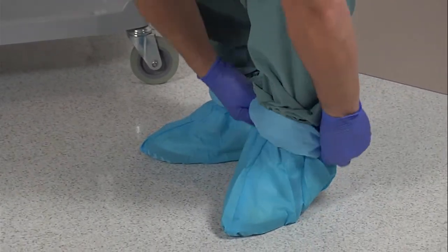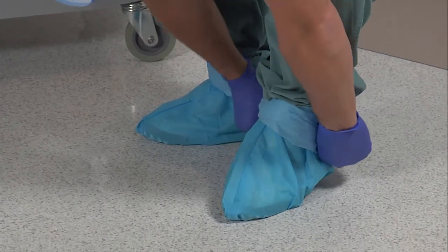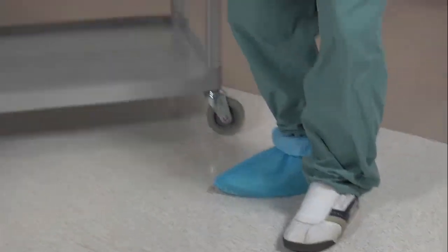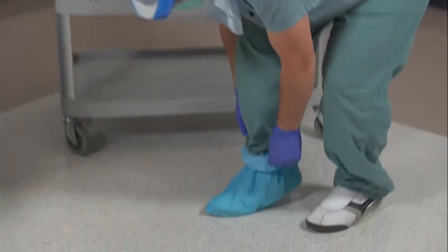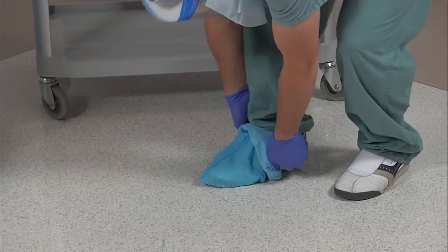Lift one heel and pull the booty over the heel. Lower your heel to the floor. Lift your toes and pull the booty completely off. Lower your toes. At no point should your feet be completely off the floor. Discard the booty.